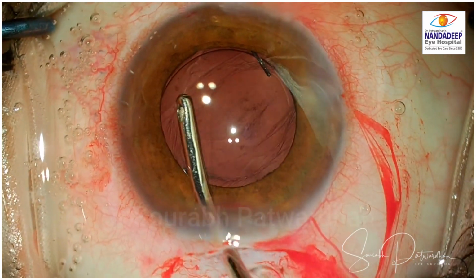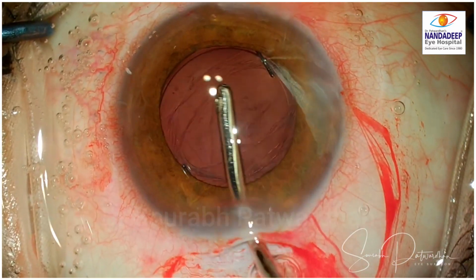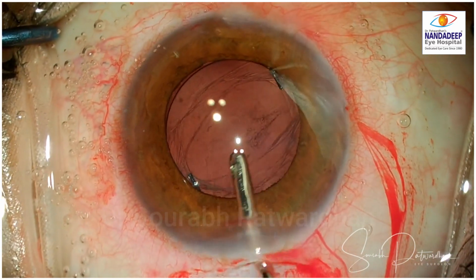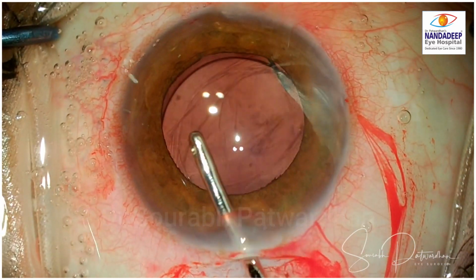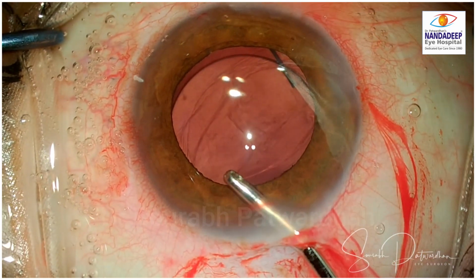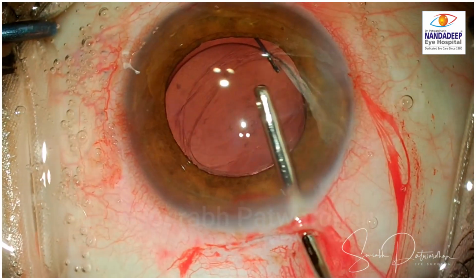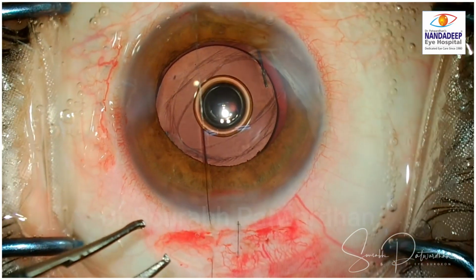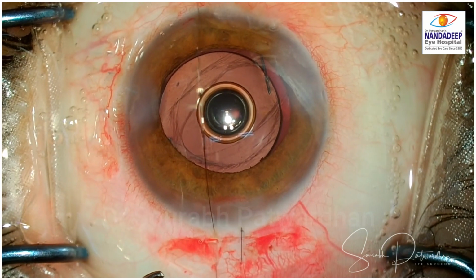Now I have done the biometry using the optical biometer IOL 700. For sulcus placement, I generally reduce the IOL power by 0.5 diopter. So if it was a 20 diopter emmetropic IOL power, I will put 19.5 diopters in the sulcus.